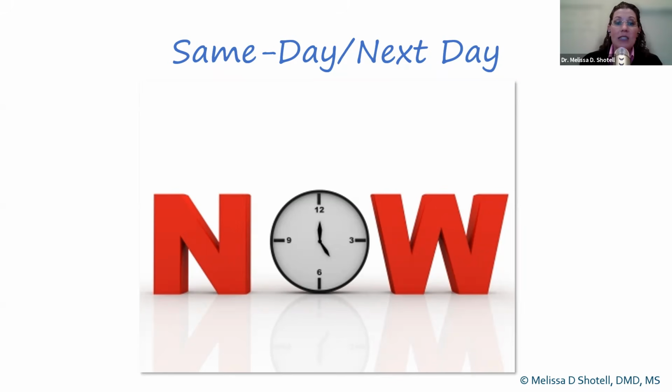If I have a patient that wants to get started right away, maybe they have a family reunion coming up or a wedding, although COVID has delayed many of these events, we can let them know that we can help them get to their goals for treatment completion by getting them started right away. Often if a patient comes in the morning, we can create one aligner and have it ready for delivery by 5 o'clock that day. Or if a patient comes in later in the day, we can try to have it ready for the next day. And for patients, this creates a real wow factor. This creates more investment for them into the treatment process because they see how efficient your office is.